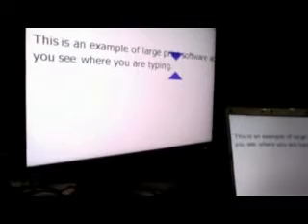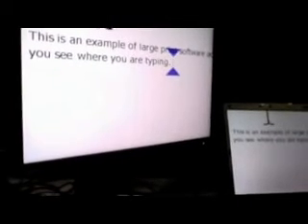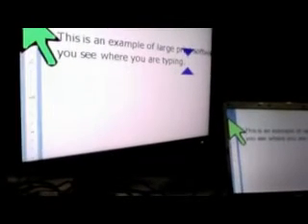So generally speaking, what happens is if a person is really using super large print, and to me, again, it's the consumer that makes the final choice, but especially when you get down to reading less than 7 to 9 characters at a time, that can impact your comprehension.